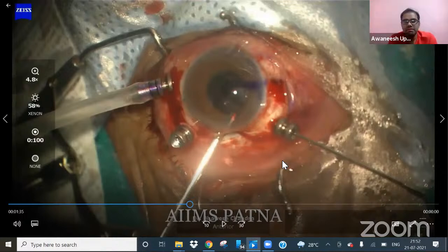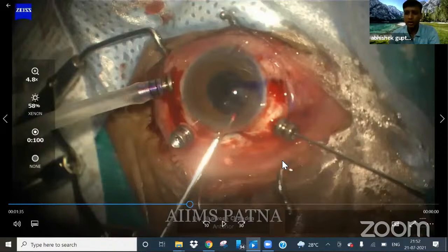Dr. Abhishek, one prerequisite is a well-dilated pupil, because sometimes we operate in a mid-dilated pupil and then it is very difficult to maneuver from the anterior vitreous into the AC, which I have learned over a period of time. If it is mid-dilating, I generally inject adrenaline in the AC and ensure that the pupil is fully dilated, especially on post-op day one or two where there is a lot of inflammation and the pupil will not dilate that much. Generally the primary surgeon is in a hurry to get his IOL explanted and implant a new one. One thing I have learned over time, though we tend to gratify the primary surgeon, is that it is better to wait, let the inflammation resolve, and take up the case after 1 or 2 weeks, when the cornea is clear and the pupil is maximally dilated. Once the pupil is maximally dilated, it is very easy to bring it into the AC by any of the maneuvers the panelists have already described. So this is very important.